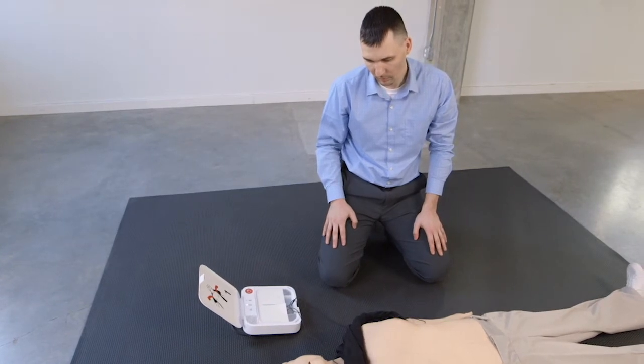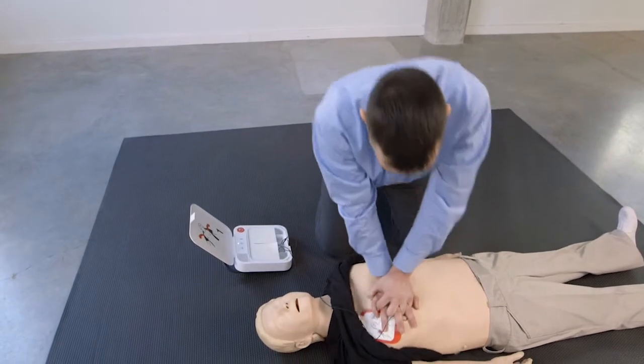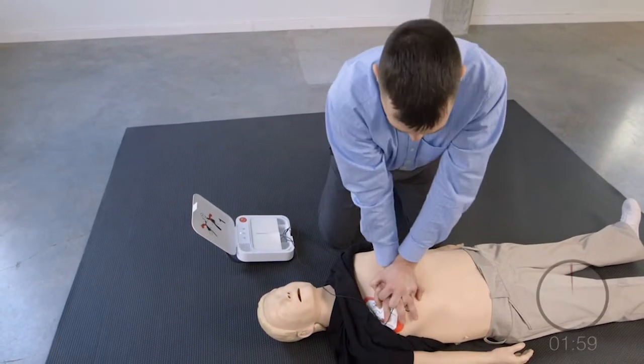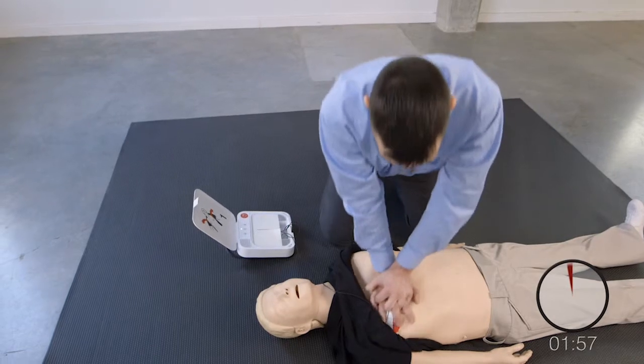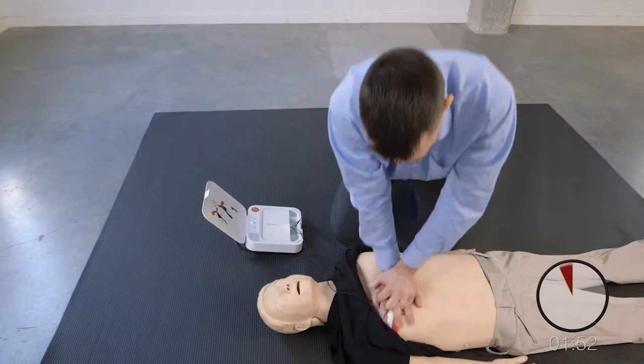Provide chest compressions to the beat. The heel of one hand should be in the centre of chest. The other hand should be on top of the first hand.